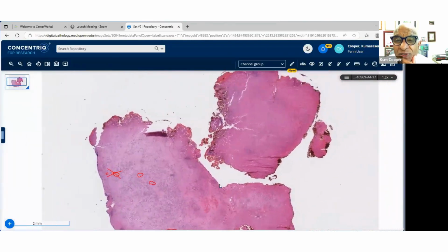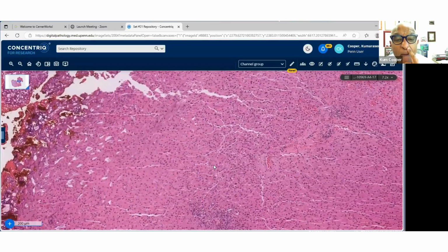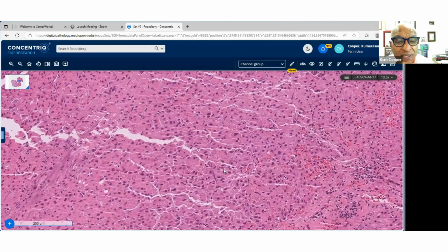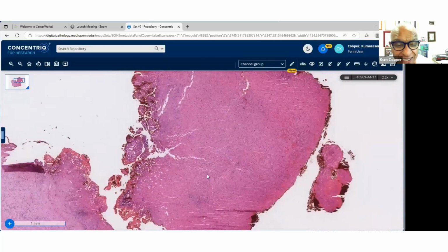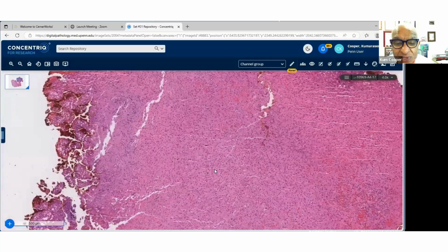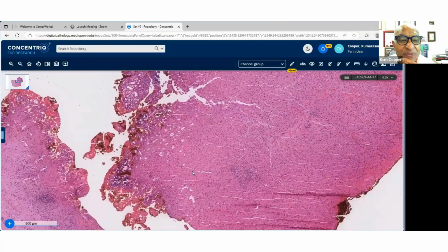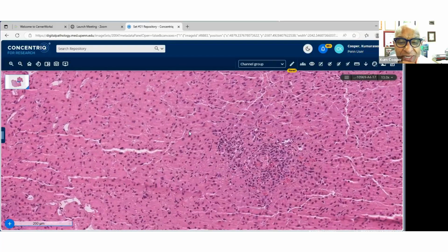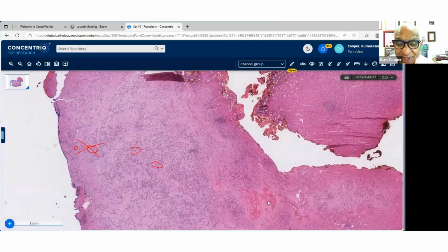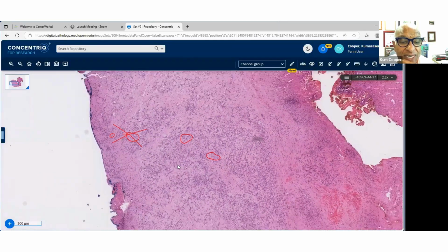And these were two of those nodules from the liver. And here you can see liver tissue, just to convince you that we are in the liver. All liver tissue, a little irritated. Here's a portal tract for those liver non-luminal GI pathologists. And here's the lesion. So just to show you at low power, you can see the lesion here. I'm trying to outline it because there is a lesion here. And I have some marks here as well. So obviously been here before.